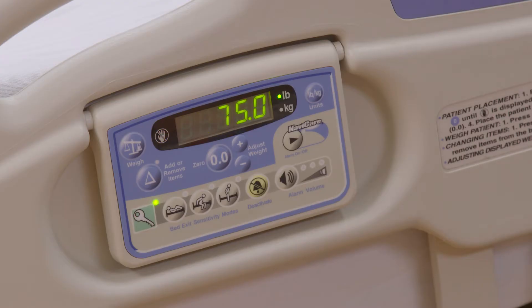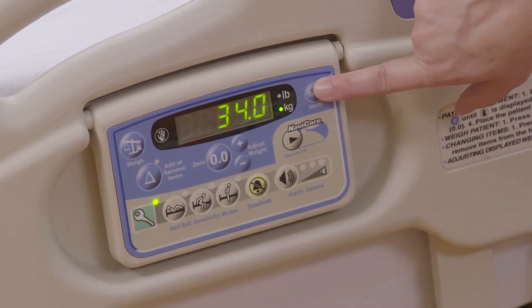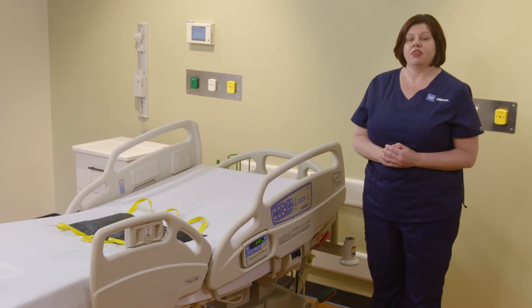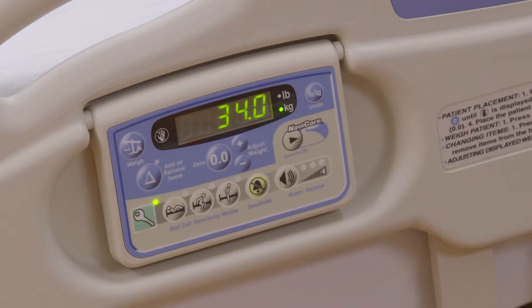The weight will calculate and display on the screen. Our patient weighs 75 pounds. You can toggle to kilos by pushing the kilo button — the patient weighs 34 kilos. Please be sure to write down this weight immediately, as you will not be able to recall this weight later.